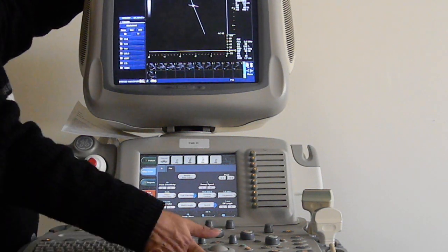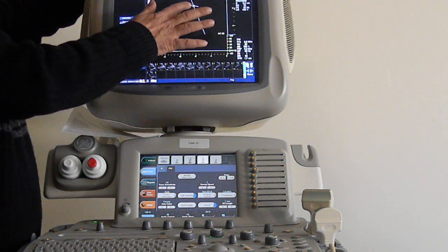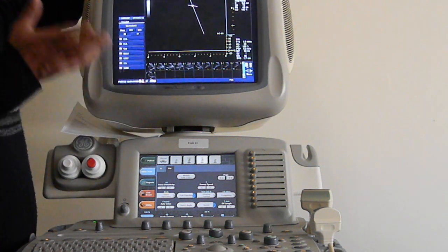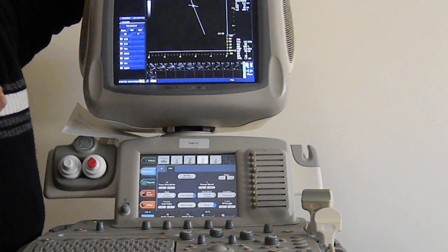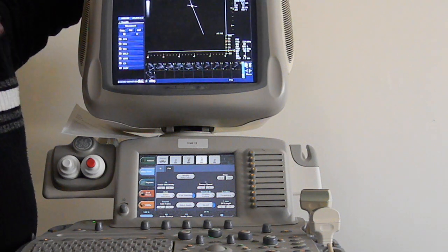Now, one thing about your pulse wave Doppler: that sample volume here, or sample window as I may call it, is always going to be in the blood vessel. Only then will you get a Doppler reading of the velocity of the blood in that blood vessel.